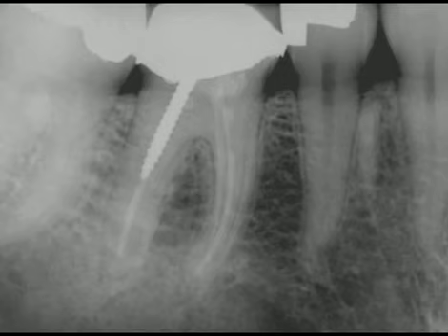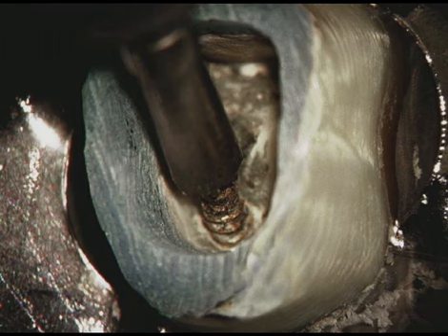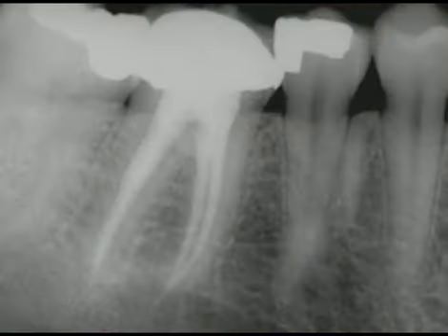This radiograph of a mandibular right first molar demonstrates a PFM crown, a screw post, and inadequate endodontic treatment. Following isolation and initial reentry, a clinical photograph demonstrates a tap initially forming threads and being drawn down to tightly engage the post. This paves the way for the torque bar, which is then utilized to back the post out of the canal. A post-operative radiograph shows the re-cemented crown and the retreatment efforts.